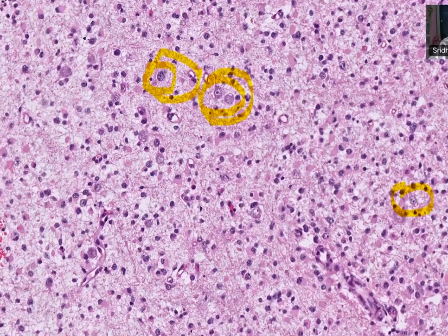So in neuro-oncology, anaplasia is a word which is a conglomeration. It encompasses pleomorphism, anisokaryosis, nuclear irregularity, hyperchromasia, all features together. You put a broader term as anaplasia. So what is the next step you want to see after anaplasia and cellularity? You want to comment about mitosis. Did you see any mitosis in this field?